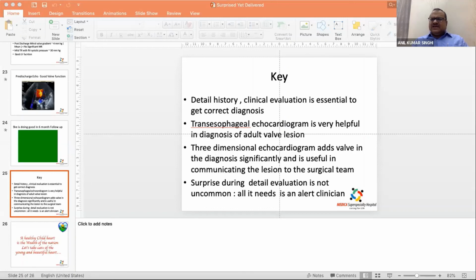Dr. Shakil, I think you can. Yeah, I think that's the reason why, if you did both the procedures in one sitting and there were problems, you're not going to know the underlying reason behind the problem. And this highlights that it's important to do it in 2 sittings. There is a right ventricular problem, and we could have made it worse by dealing with it in 1 sitting.